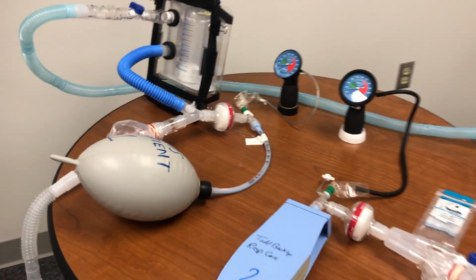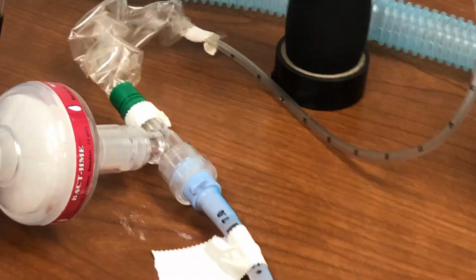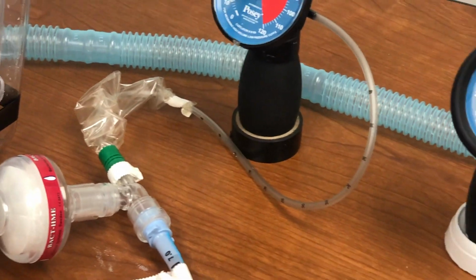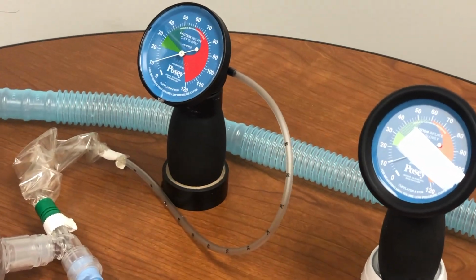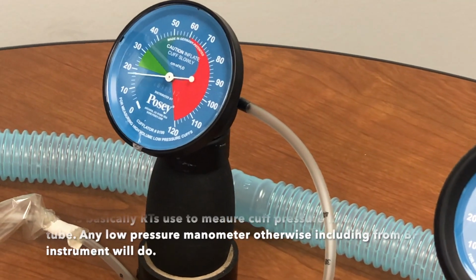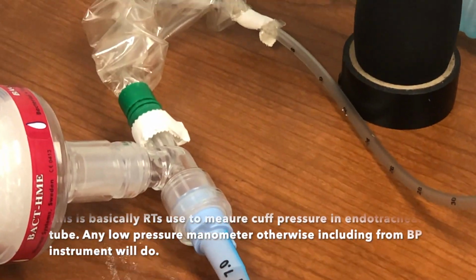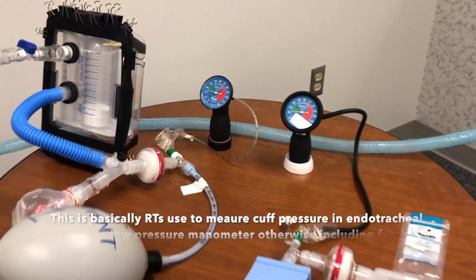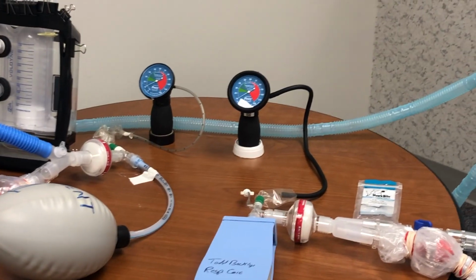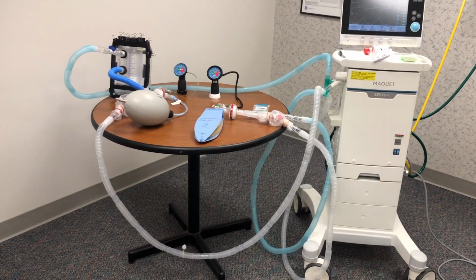And then to the patient. Now, if you see where the endotracheal tube is, we have attached a suction tubing, but I have cut the suction pipe and attached this manometer to it. This manometer measures the pressure directly at the patient, up to the endotracheal tube. So it is actually more sensitive than the ventilators, where some newer or older ventilators measure pressure directly at the ventilator, but what we are doing is measuring pressure at the patient.